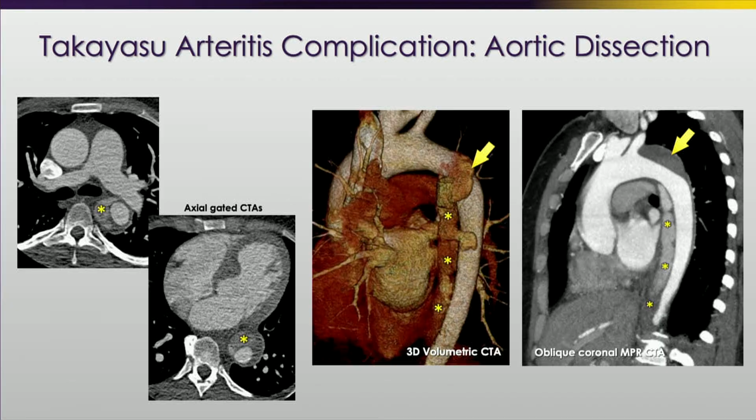Secondly, no one is going to put an endograft in this patient because, again, endovascular intervention is, in many cases, contraindicated. And this patient was just followed over a period of months to years. And this type B dissection partly resolved over that time.